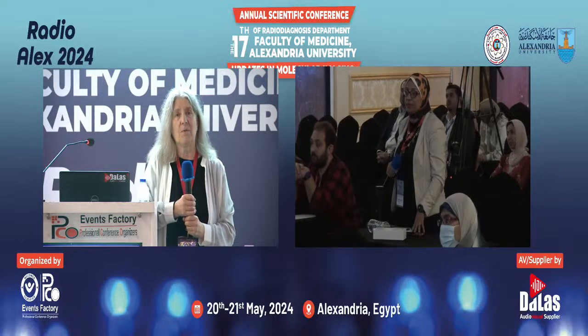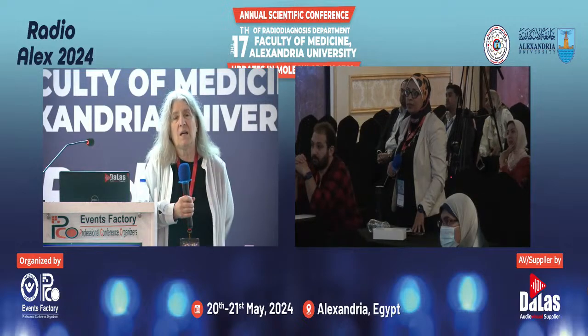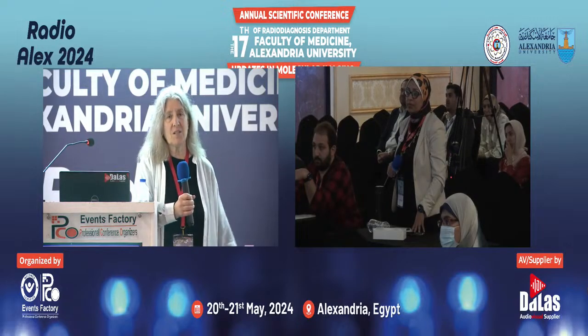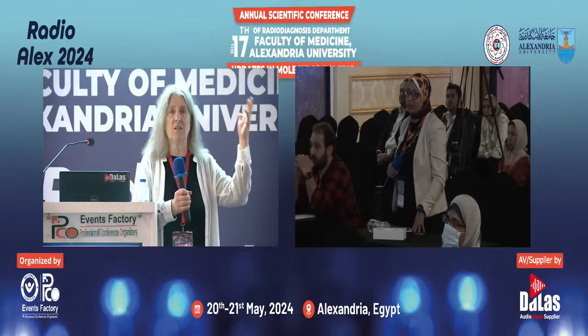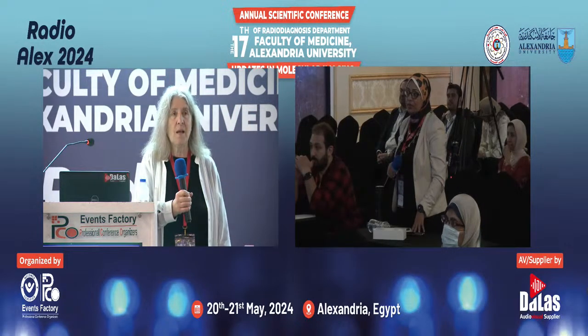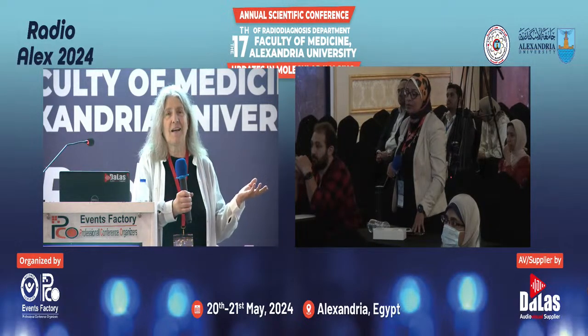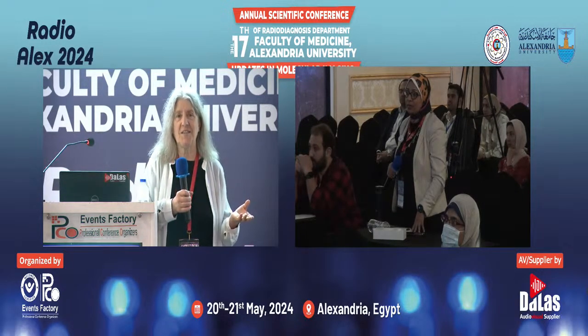But very often in peritoneal carcinomatosis, if it's a mucinous tumor, the uptake even to begin with can be fairly low. That's the problem if it's a mucinous tumor. In my own experience, not based on the literature, peritoneal carcinomatosis that's initially hypermetabolic, usually you'll see a decrease on CT, either completely gone, or I usually judge that more by CT than by PET, to be honest with you.